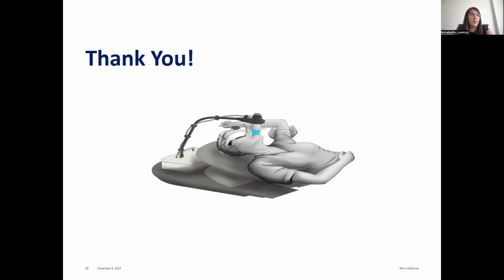Yes. If I can add something to that, studies were made by the physicist that designed the SDX 20 years ago. He came up with 85% because it was the best ratio between keeping the patient comfortable and having all of the anatomical advantages of doing the breath hold. If you want more information, I'm sure we can put you in contact with a physicist at Penn. Perhaps they will have more information.